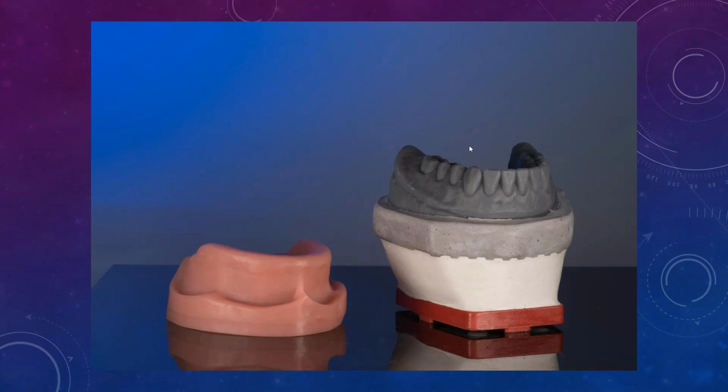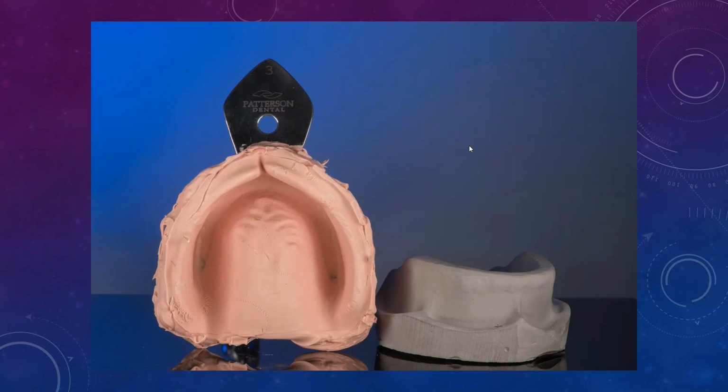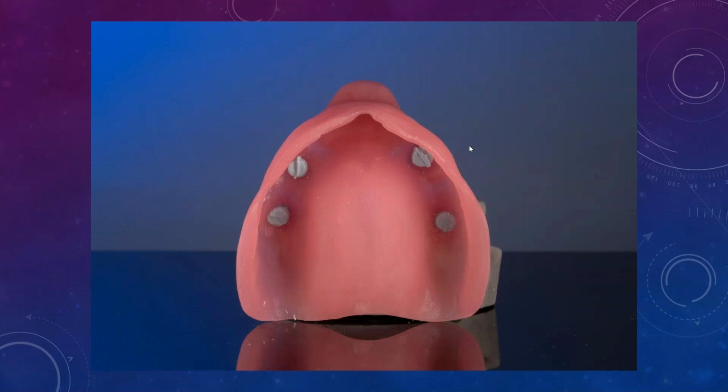So for your initial planning, let's say you have a patient that presents either fully dentated on the mandible, or you have a full denture on the mandible, or you have an implant supported or retained denture in the mandible. On the maxilla, the patient's fully edentulous. So where do we start? How do we go from here? What I basically do is just follow regular denture protocols, guys. So you take a regular initial impression with alginate or an alginate substitute like you see here. Then you make a custom tray.